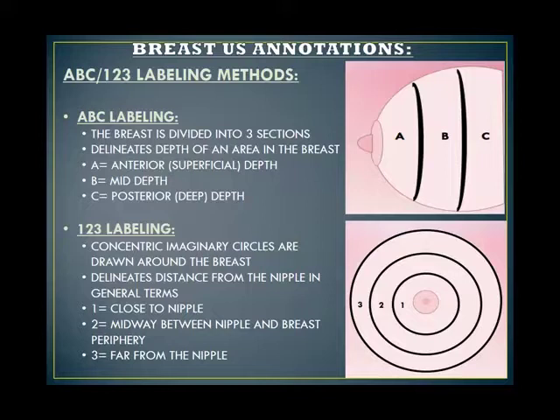All right, so this is an outdated method of labeling, but again, on the ARDMS breast exams, you have to know it. Back in the day, probably about 15 to 20 years ago, they didn't have centimeters from nipple. They hadn't invented that yet. So they used to do this type of labeling. And every once in a while you might see this at a really rural breast center if you get outside images from them. So it's important to know what it means. But it's not a very accurate way of telling you where things are.